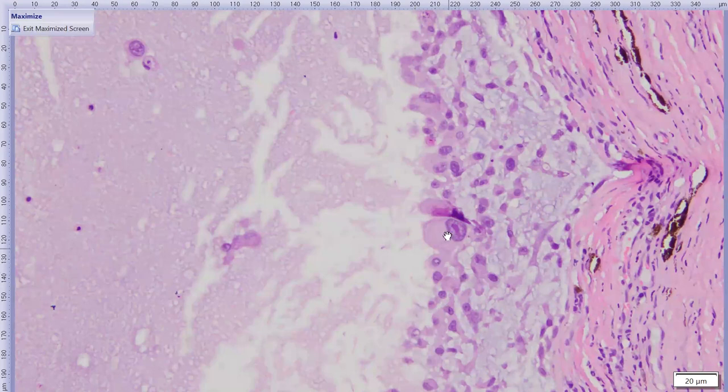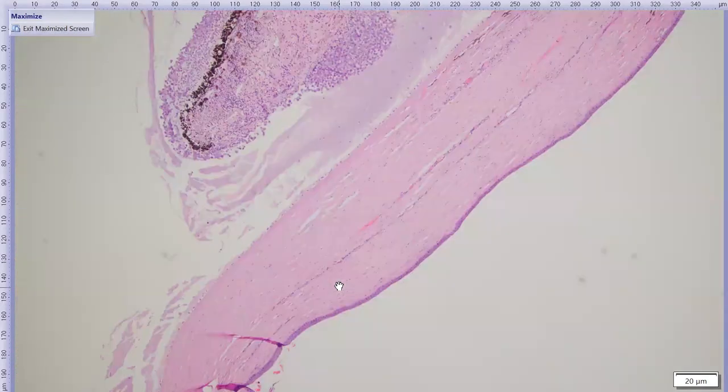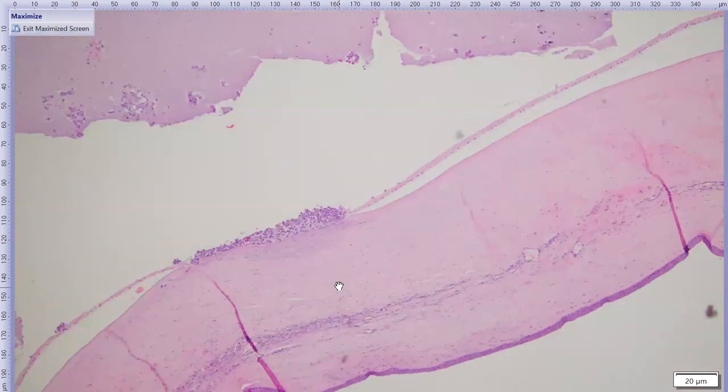Another feature that's kind of interesting in these cells is the way these nuclei are often eccentric, easier to see on this giant cell compared to some of the other ones. And maybe something of a perinuclear clearing, like these cells might be making something. And then probably better seen, sorry to zoom around on this side.